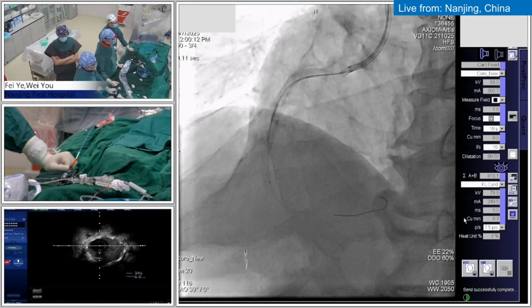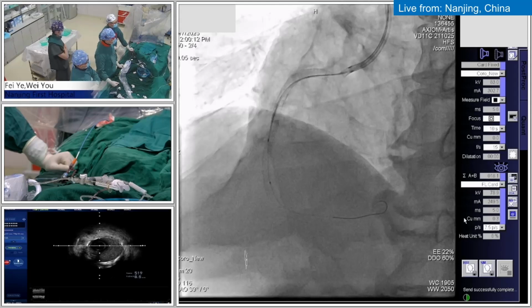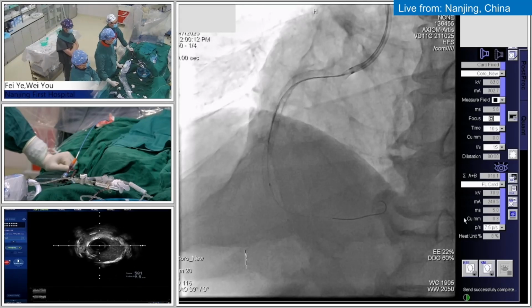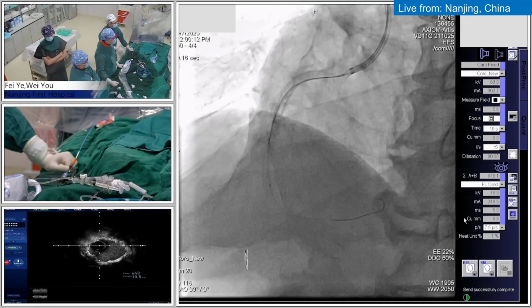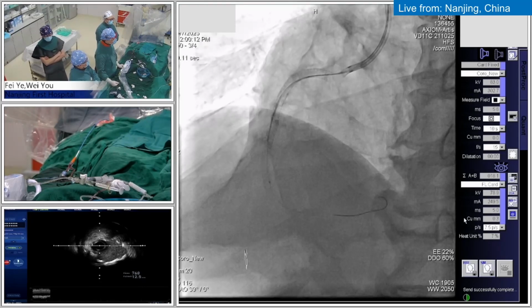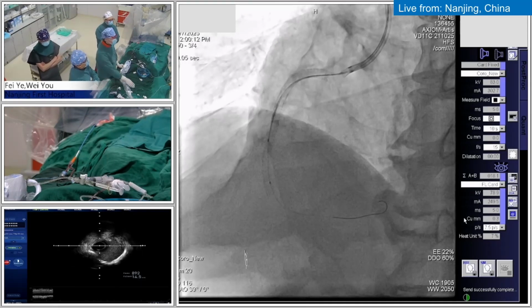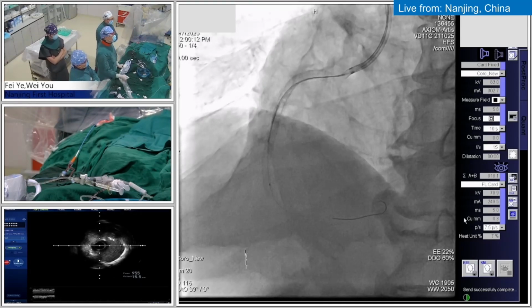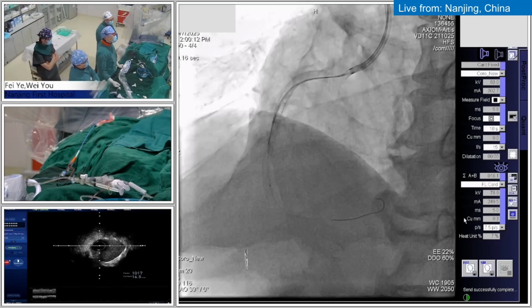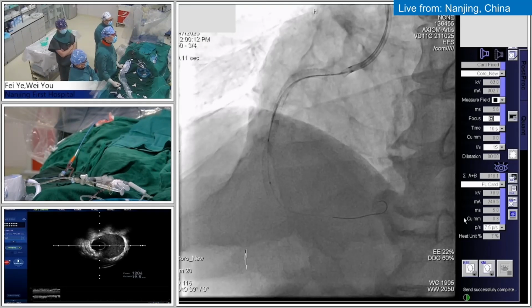Sometimes we find after stenting that the stent is under-expanded, and the bailout strategy is very, very limited. So that's what you always teach us: use a big-size balloon, not a smaller one, to prepare. Just a 1-to-1 NC balloon. Even though we find a crack, multiple cracks, or maybe a single crack, a 1-to-1 NC balloon predilates. After that, we put in the same size of stent. Okay.